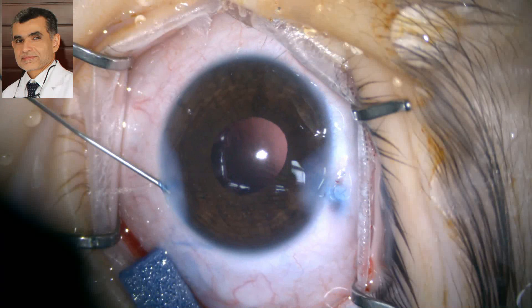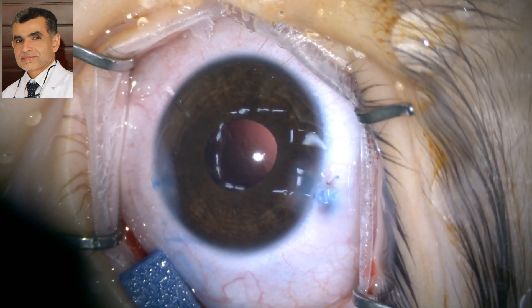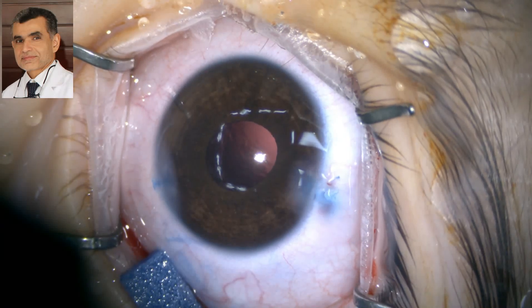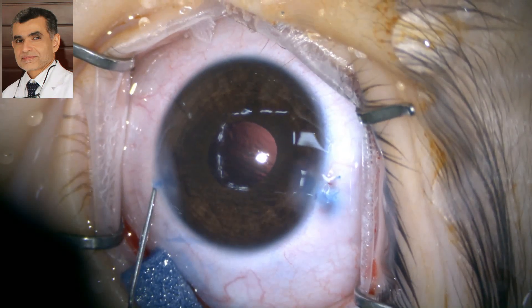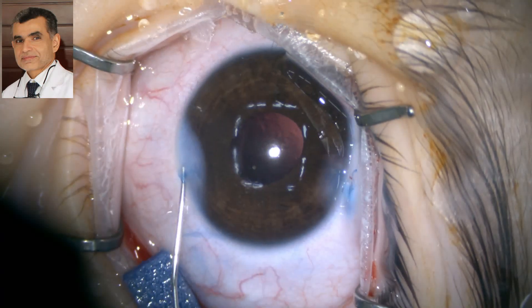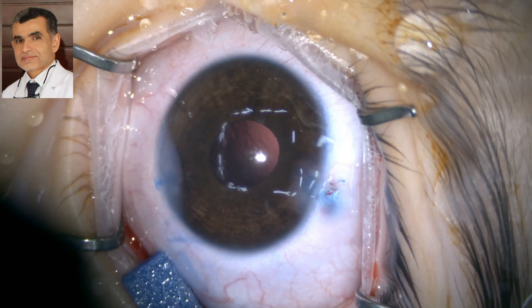We hydrate the side ports to check for any leak and assess whether sutures are needed — sometimes they are self-sealing, sometimes a suture is required. If there is any doubt about a leak, it is not harmful to place a suture and remove it after one or two weeks. The induced astigmatism will not be significant, and it resolves after suture removal. We fully inflate the eye and test the wounds for leak. Thank you very much.